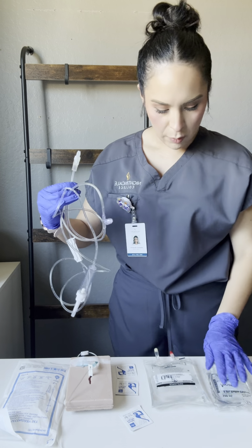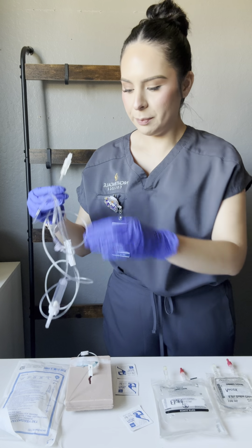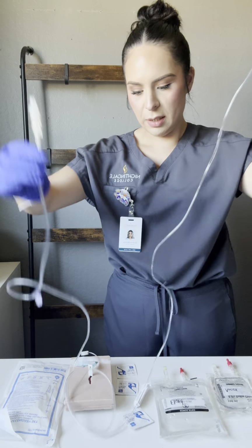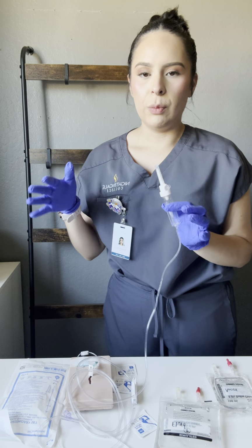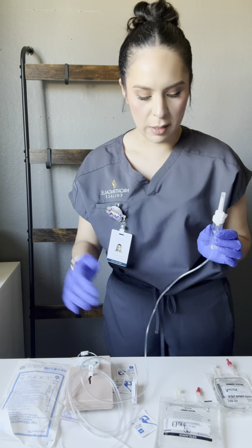The first thing that I'm going to do is spike and prime my fluid. When removing the cap from the spike, you want to make sure you're maintaining sterility throughout the entire process.